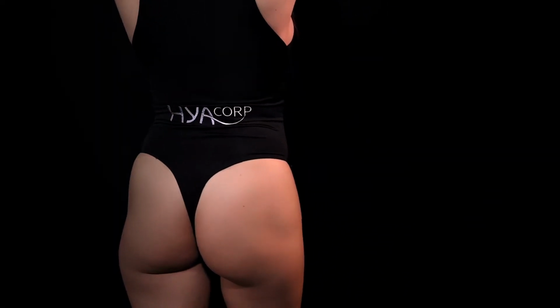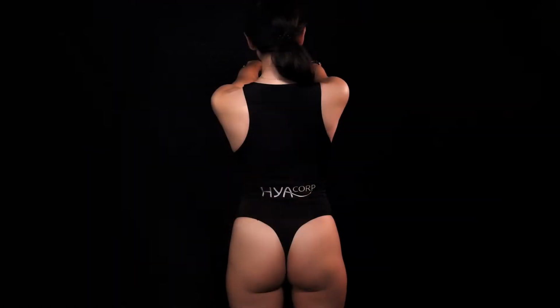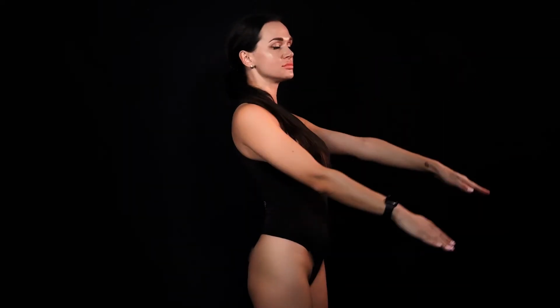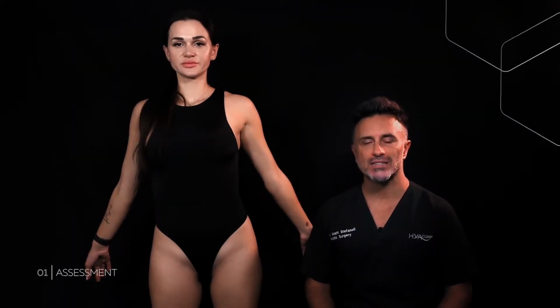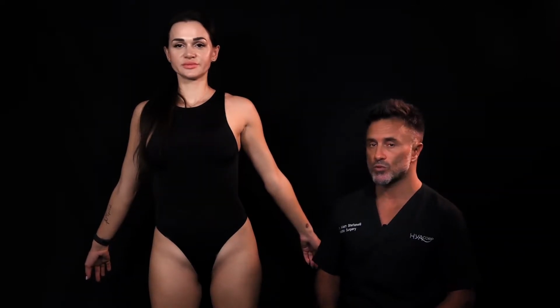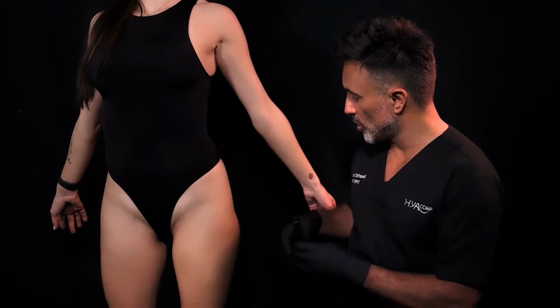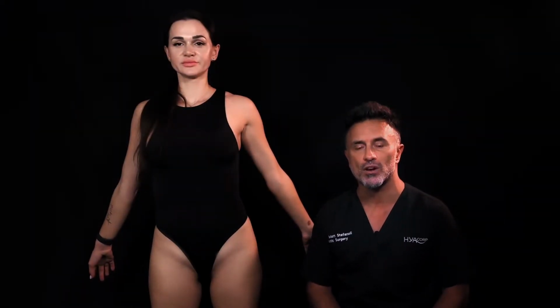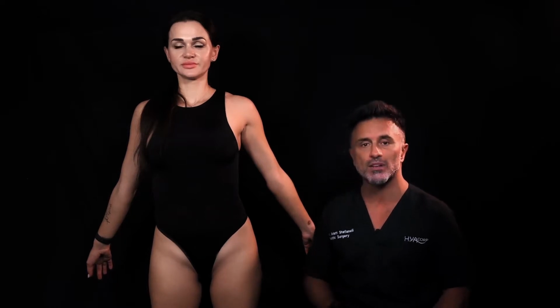have a little enhancement. When it comes to the assessment of the buttock for any procedure, surgical or non-surgical, we need to assess the patient in a standing up position from the front, from the side and from the back. As you can see, we start the assessment of the buttock region from the front. Why? Because we want to assess the presence or not of hip dips. In this case, you see that there is no hip dip on the left, a little bit on the right, but actually this is not the concern at all of Rada.